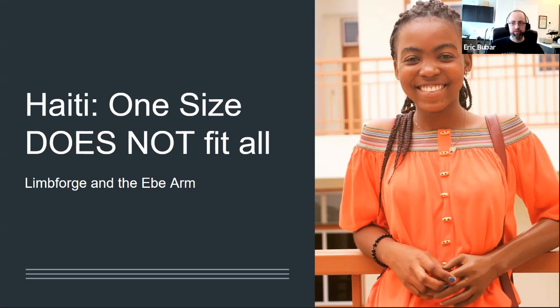And what they found was they were considered voodoo hands. They were considered kind of taboo because they looked very cartoony. So what they needed was something more realistic. So they created this cosmetic kind of device. Again, we can now create cosmetic devices using similar technologies and techniques.